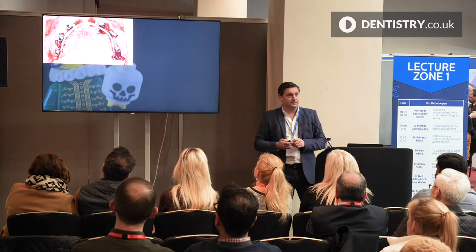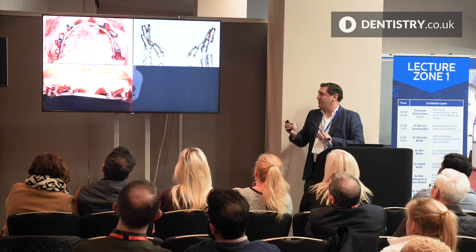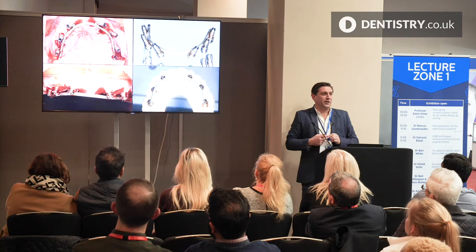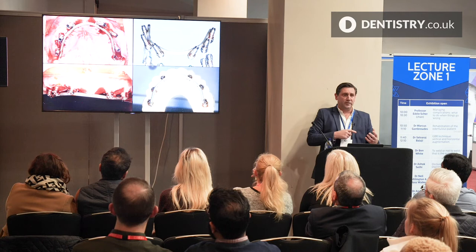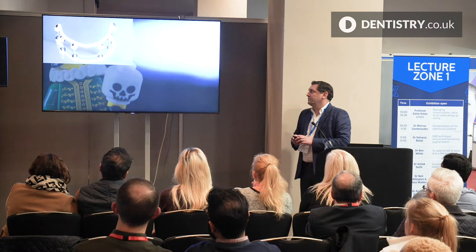That's then spot welded in place, and you wouldn't be able to remove them or break them from the titanium wire. We then put that back into the patient's mouth. Check that it fits within our shell that we've had pre-made prior to the surgery. So we've taken study models, done the diagnostic wax up, and got what we call a white shell made. So that fits within our shell. We then opaque the titanium framework.